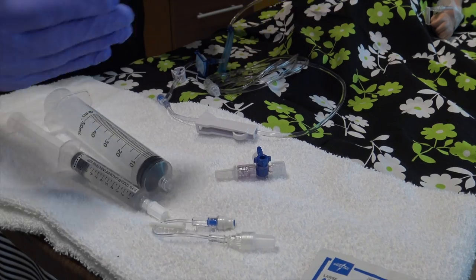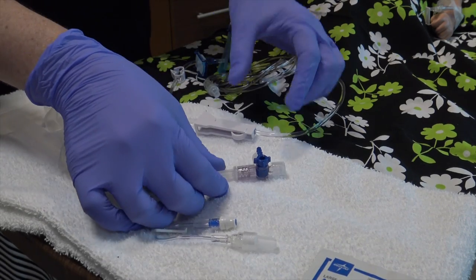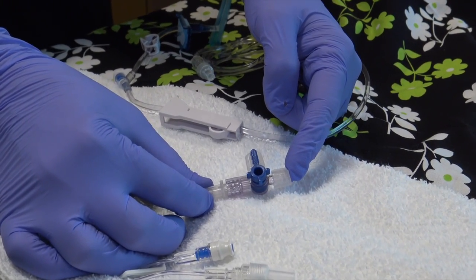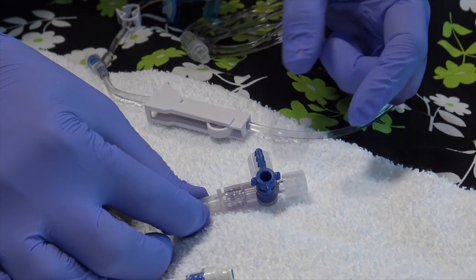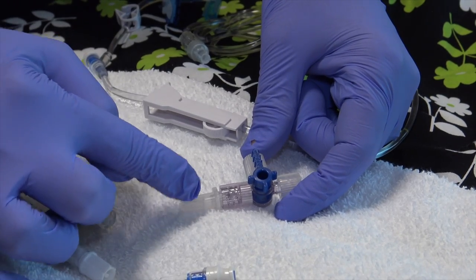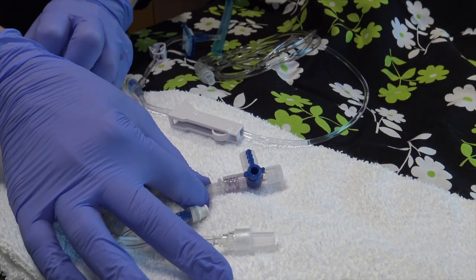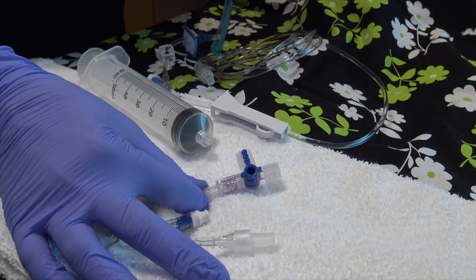Now you're ready to connect your IV fluids, once the line has been primed, to your stop cock. This is a typical stop cock. You have three openings to the stop cock. This end here, which is a female opening, will be the end that you will plug your IV fluid line into. The opposite side is the male opening, and that's the one that you'll connect to your T-connector that's connected to your patient.